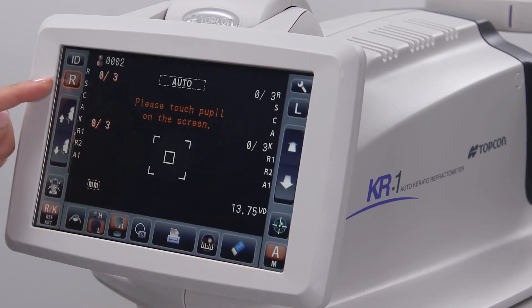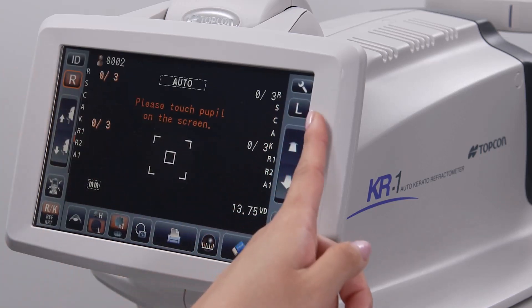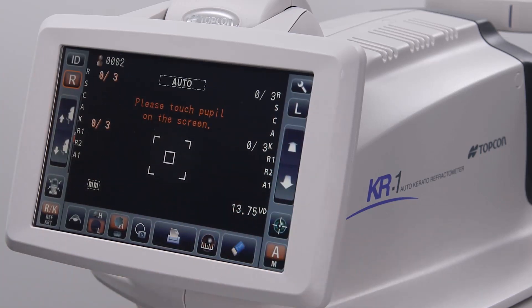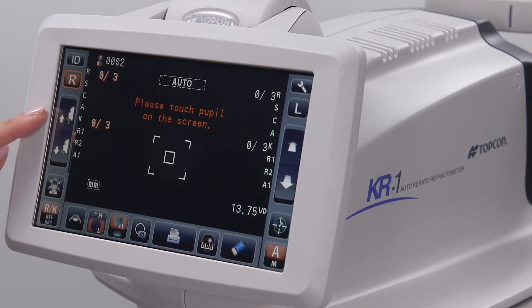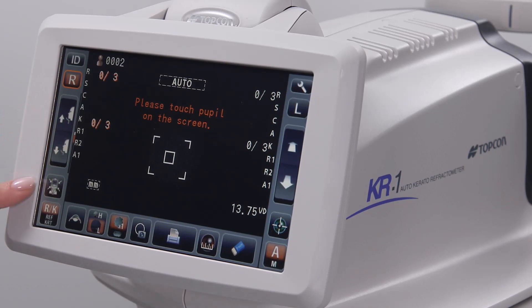Near the upper left and upper right corners are the R and L icons indicating which eye is being tested. The chin rest icons control the height of the patient's chin rest. The position reset icon moves the measurement head to its default position to be ready for the next patient or to shut down the device.